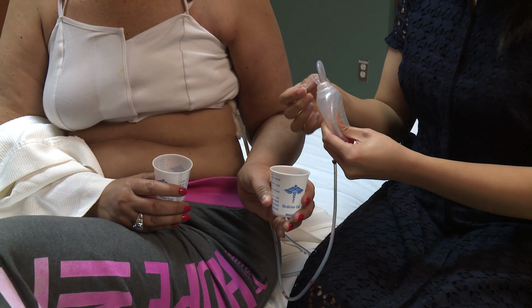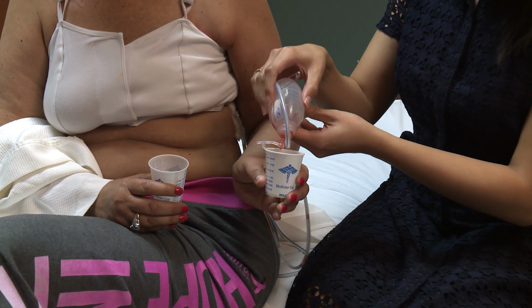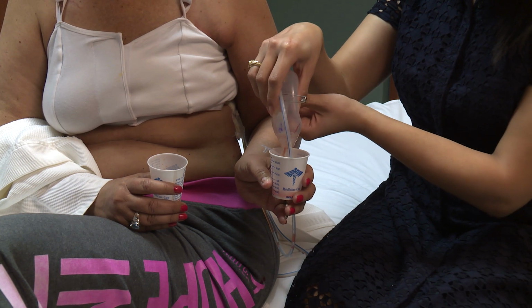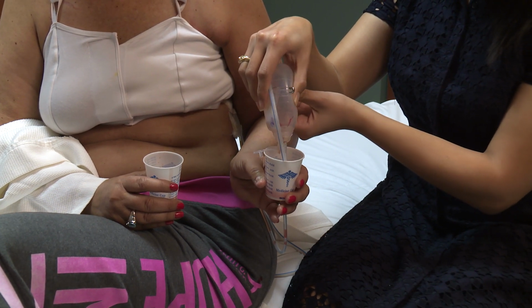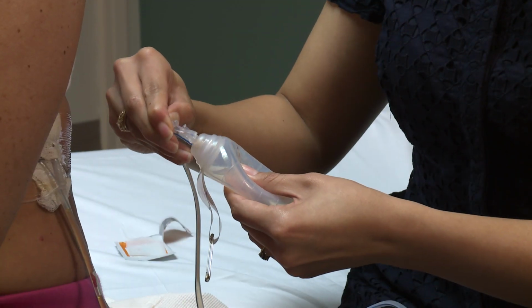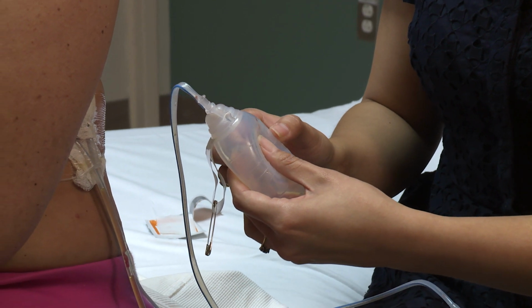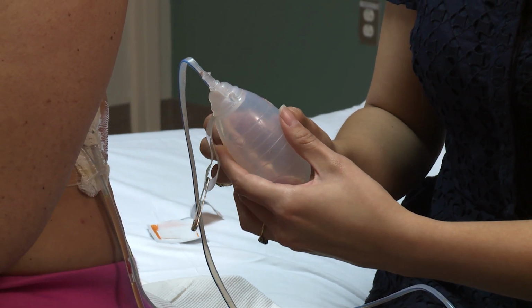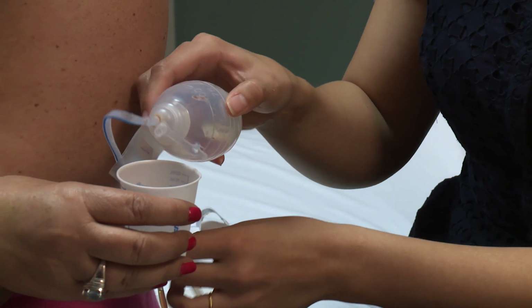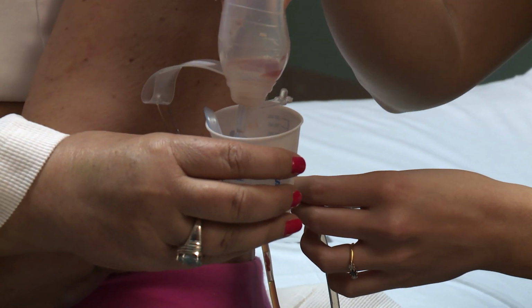At least 2 times a day after you have stripped the drain, empty the fluid collected in each bulb into a separate measuring cup. To empty the bulb and measure the fluid, follow these steps. After stripping the drain, unplug the stopper from the emptying port located at the top of the bulb. Tip the bulb upside down over the measuring cup. Gently squeeze all of the fluid from the bulb into the measuring cup.